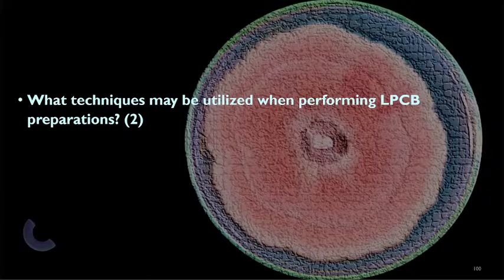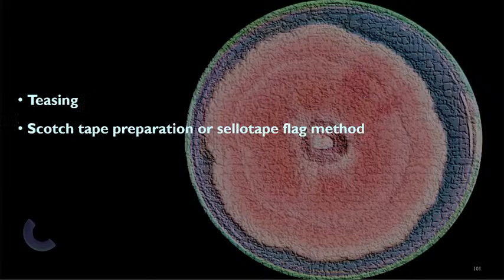Techniques that may be utilized when performing LCPB, specifically if the specimen is a little too hard to see visually, we can do teasing or we can do scotch tape preparation or the cello flag technique. Ang gagawin nyo lang sa cello flag technique is parang kukuha kayo ng papel.